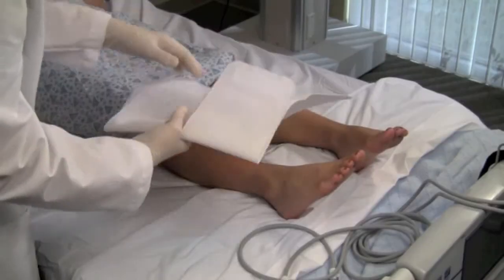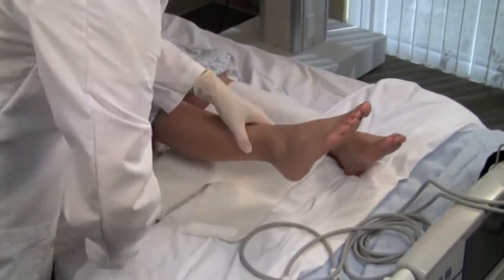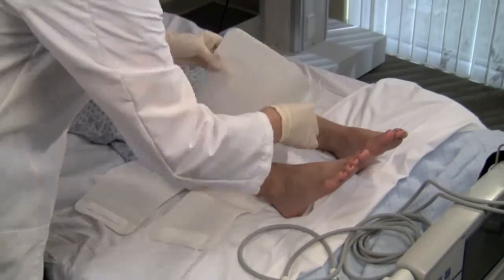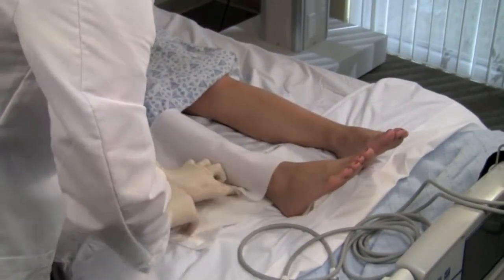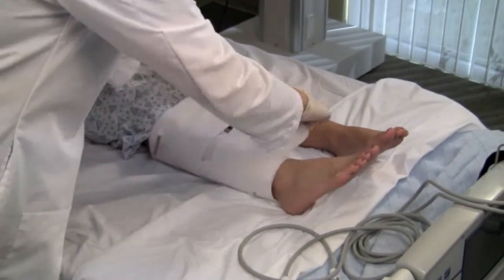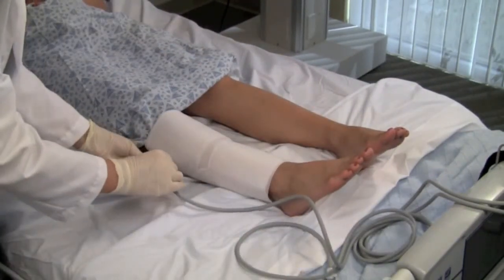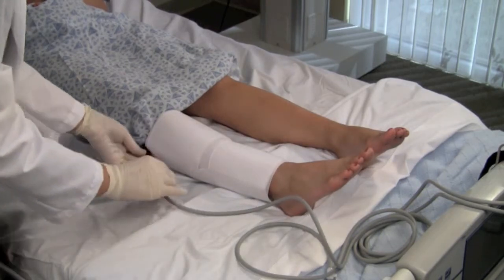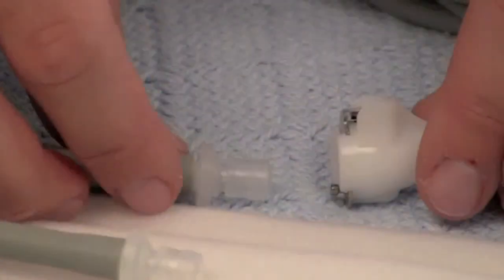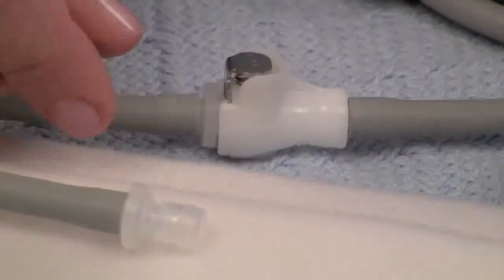Calf garments may be used on either leg and should be removed regularly to inspect the skin. Unfold the garment and position the inflatable center bladder directly behind the patient's calf. The outlet tube on the garment should not be in direct contact with the patient's skin. Snugly wrap the garment around the patient's leg and secure the hook tabs. Attach the garment to the tube set by pushing in the silver latch on the female tube connector and inserting the male garment connector firmly into the tube connector until a click is heard.